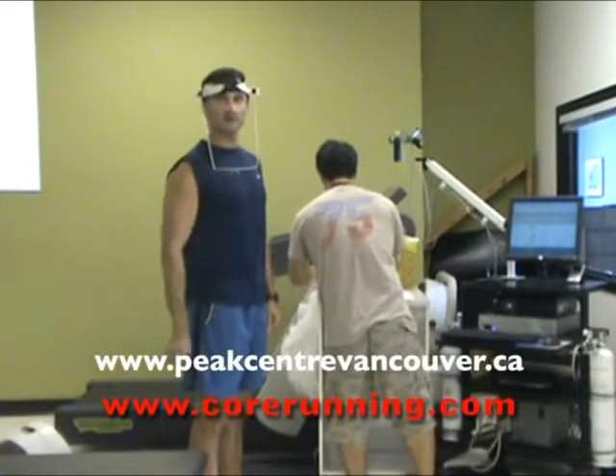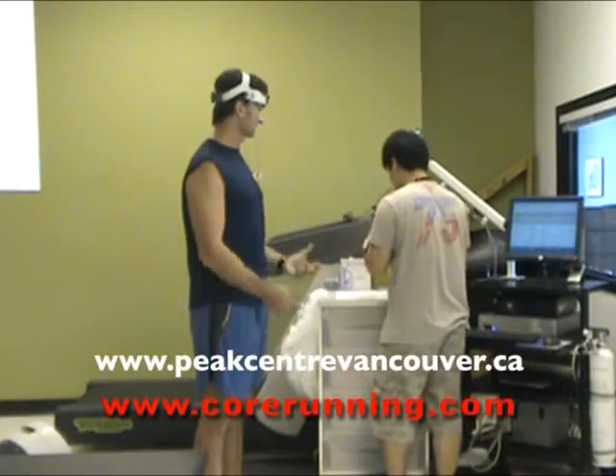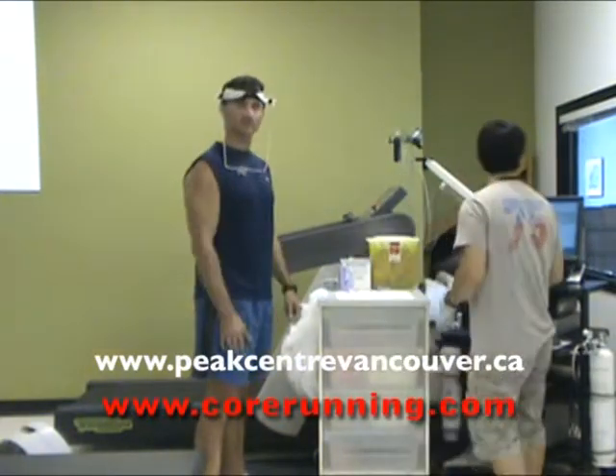Paul's just set me up to do the VO2 and lactate threshold test. He's put on the head gear here and we're going to get into it and see what it's all about.